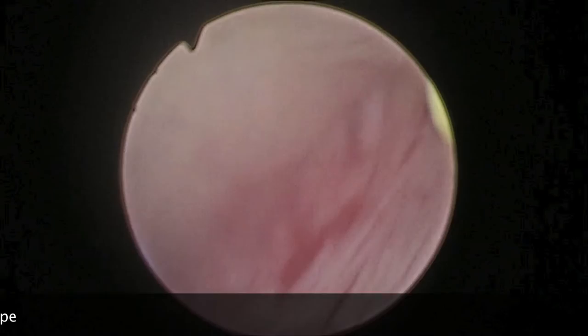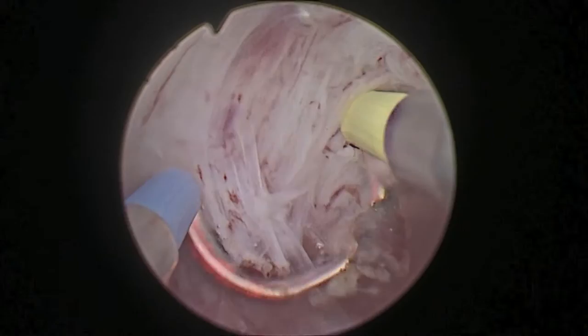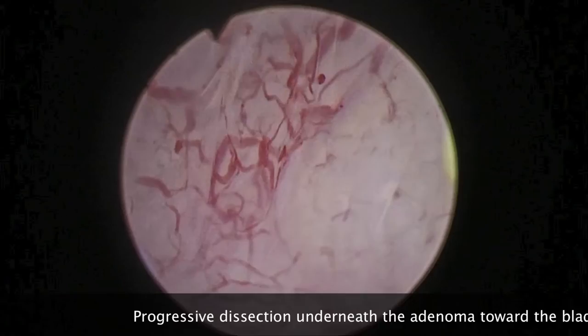Manipulation of the scope gently continues to dissect the adenoma off the surgical capsule, and the hot loop is used to cut any attachments that resist blunt enucleation. The dissection is continued bluntly underneath the adenoma towards the bladder neck.